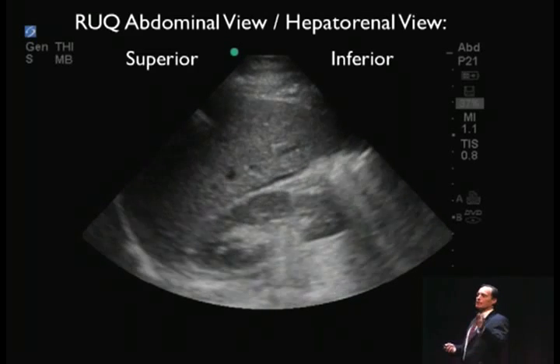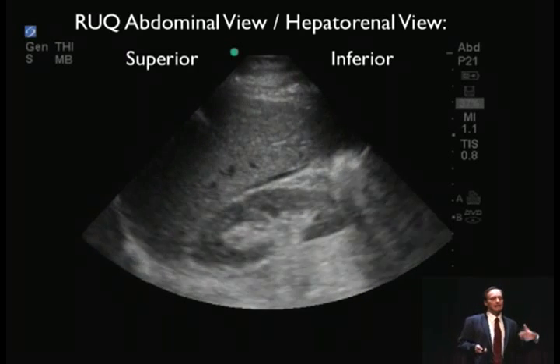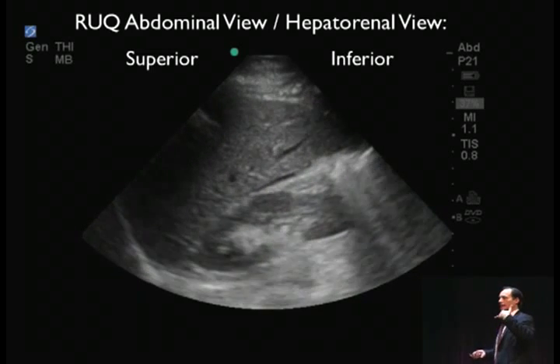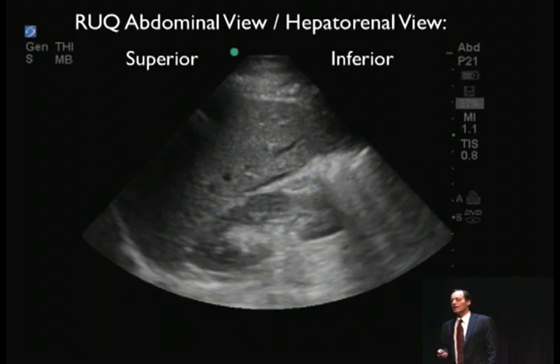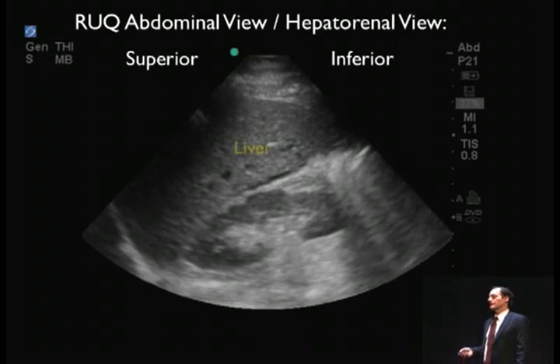So based on this, his blood pressure actually went down after that. They took him to the OR, and unfortunately he had a liver laceration. He had basically an abdominal mesenteric intestinal injury. And so he actually had a lot of trauma going on. But that was all we saw. But based on that, we said positive.